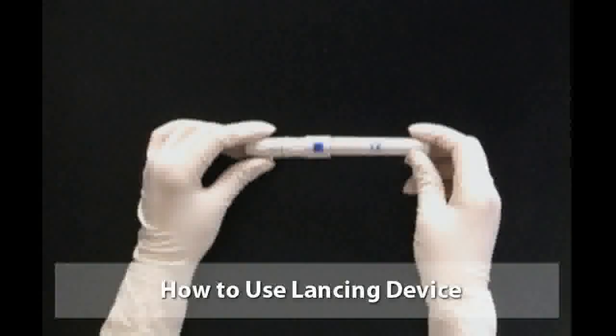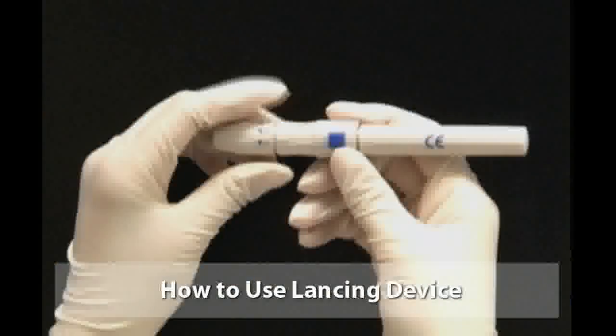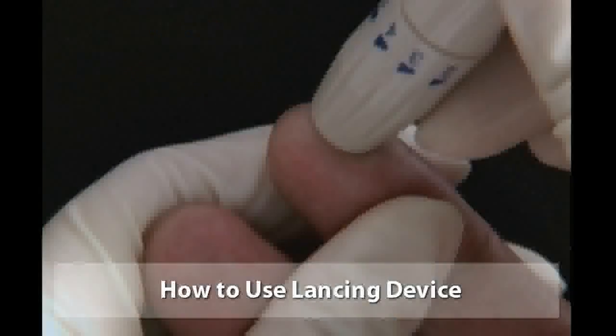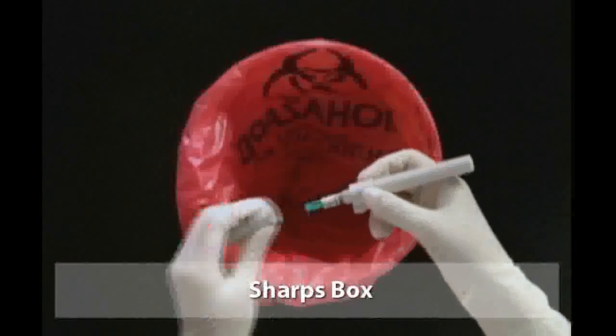Pull out the lancing device body as far as it will go and then release it. It makes lancet ready to prick. Push the blue button on the lancet device. Inside lancet will prick the patient's finger. Discard the lancet immediately after pricking the finger.